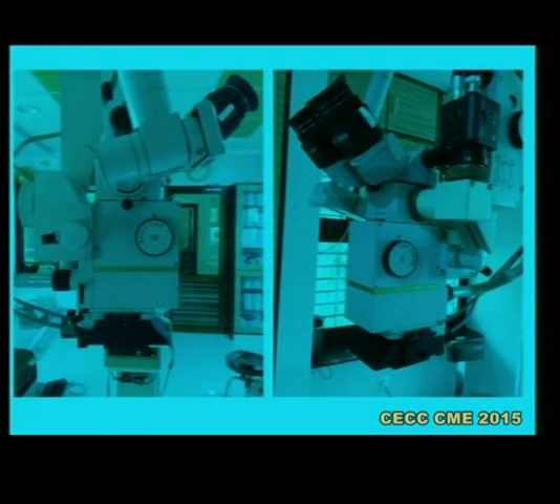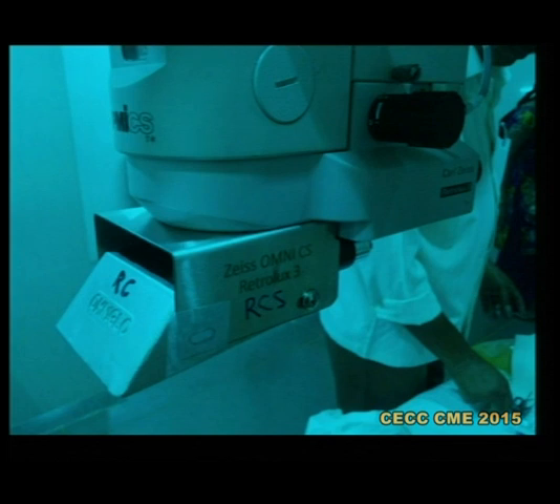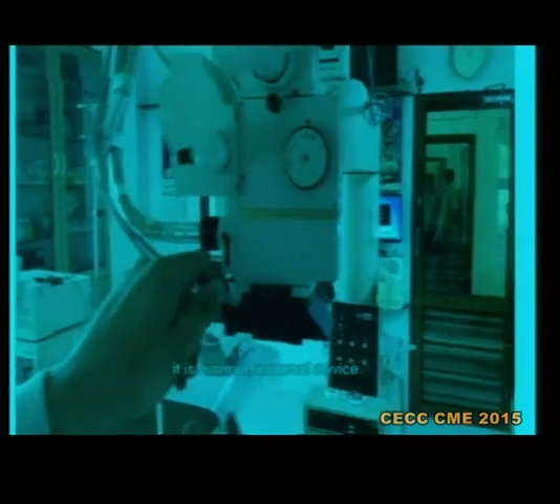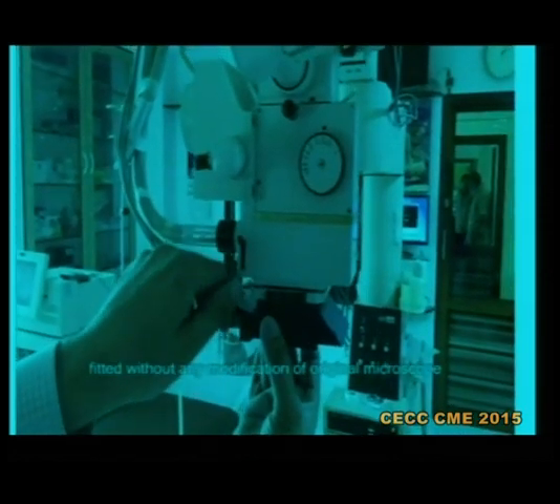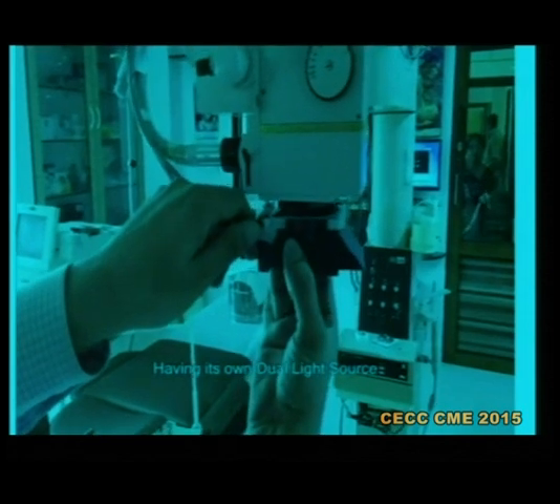This is how the device gets fitted under the microscope. This is my Carl Zeiss Jena microscope. I have made an adapter so far for Wild or Leica M690, also one adapter for Zeiss OPMI-CS, and an adapter for Zeiss 1FR. As you can see, this device externally couples to your microscope without altering the surgical distance. There is still enough gap for clearance between the instrument tip and the OmniGlow. It is an external device which can be easily detached or attached under a microscope in no time — you just unscrew one screw to remove or attach it.